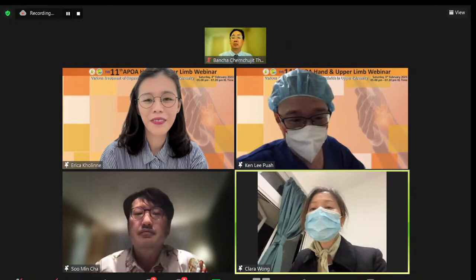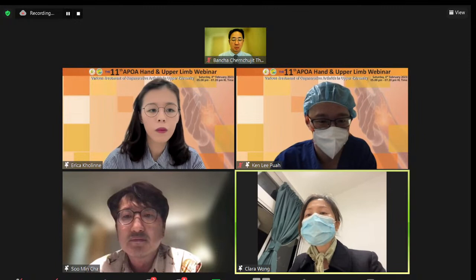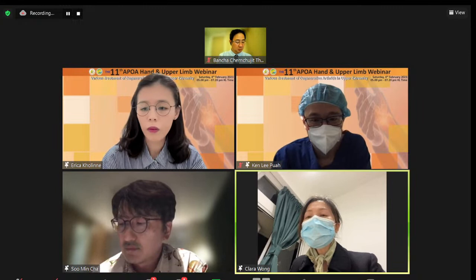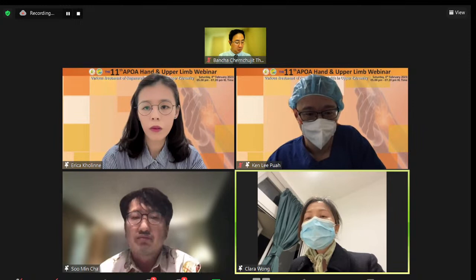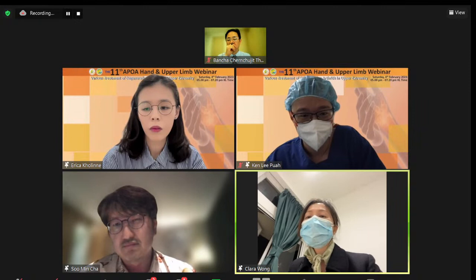So for the question of how we differentiate a condition related to post-traumatic arthritis from one due to heterotopic ossification, sometimes it's not difficult to differentiate from a normal X-ray. In the X-ray, you can differentiate the position and the site of the abnormal new bone. But I think the CT scan is very helpful. There are indeed three conditions that sometimes make us confused. Sometimes the fracture site may have new bone formed around it, but we can't categorize it as heterotopic ossification or post-traumatic arthritis.